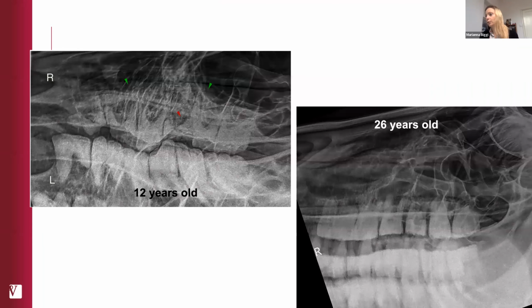It's also quite useful to know the age, because some of the changes may be more relevant in younger horses than maybe in older horses. We do expect a certain degree of clubbing of the roots in old horses, and perhaps some small diastemata, just because of the shortening of the tooth that makes these spaces become slightly wider than they normally are.